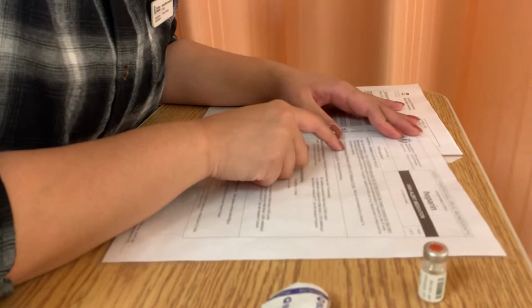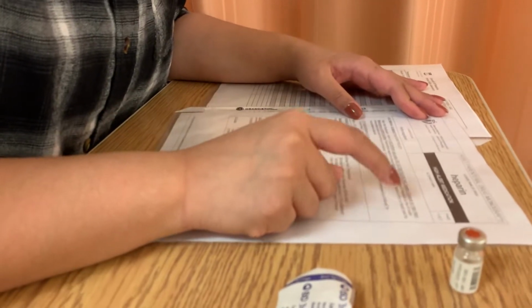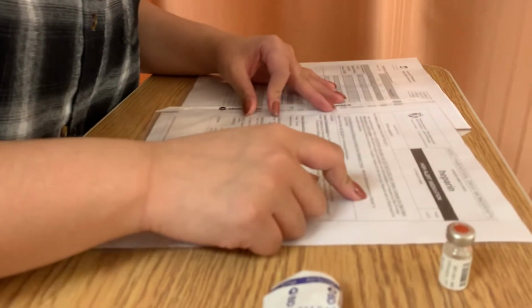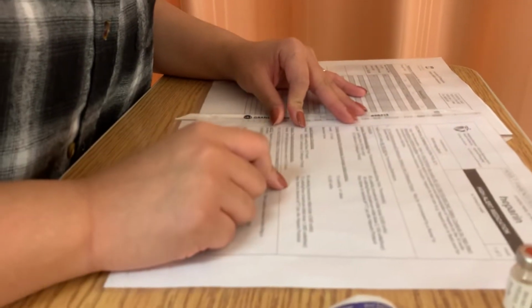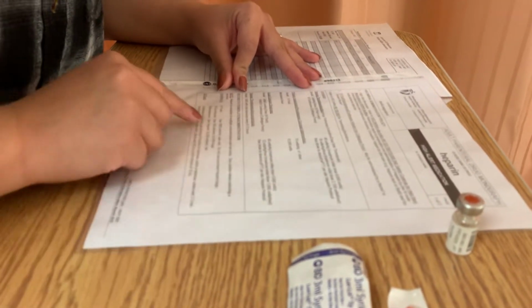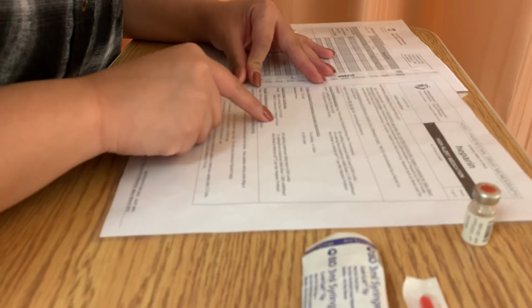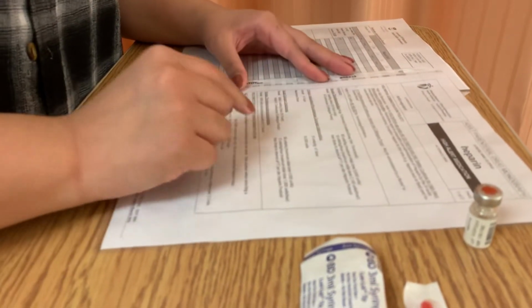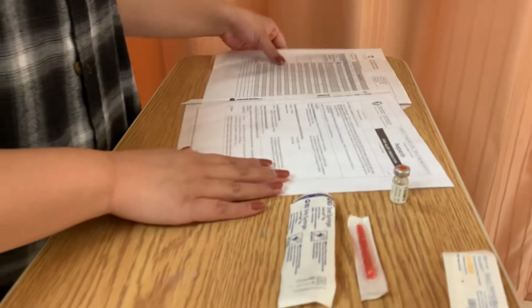So first, subcutaneous is allowed. It may be administered by nurse or student nurse. That is me. So perfect. I'm going to check if there's any extra information about giving this subcutaneously, and it doesn't say there's any special information, and it says here 5,000 units subcut every 8 to 12 hours, which is perfect. I'm only giving 5,000 units. Okay, so I've checked that.